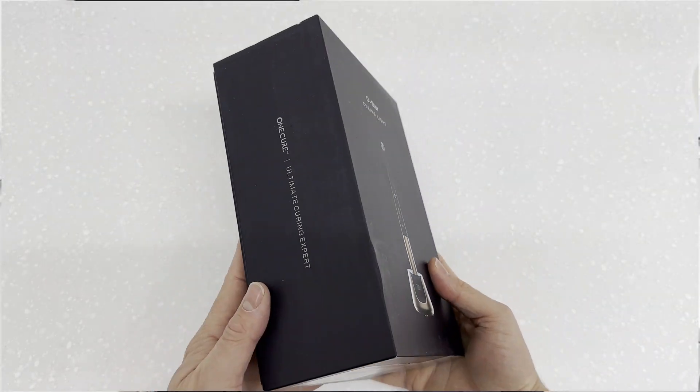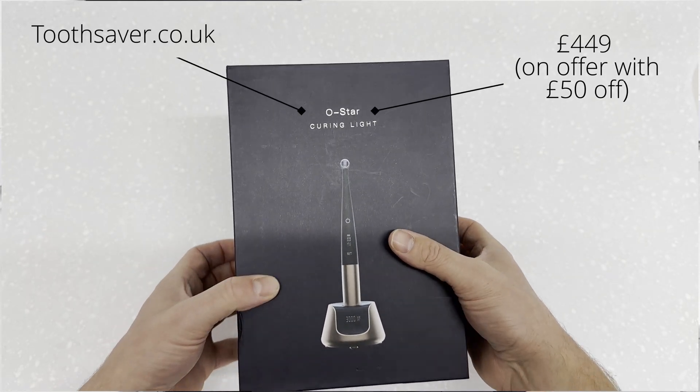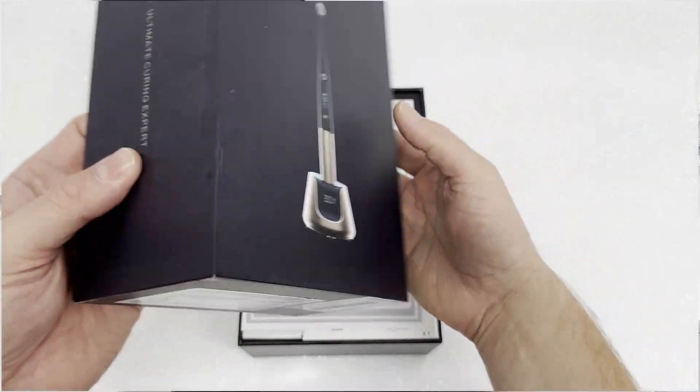This is the Ostar curing light from Woodpecker, and it was given to me by toothsaver.co.uk. This unit retails for around £449 at the time of this video, but this price was part of an offer with £50 off.